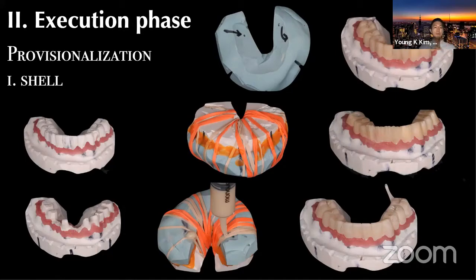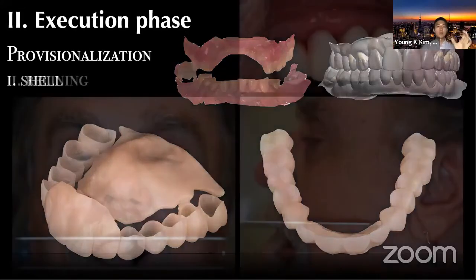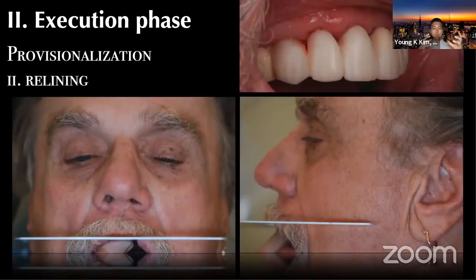It's also very important. It's a great way of learning how to handle those with the basic principles behind the shell fabrication. And we have scannings, and we can mill the PMMA, and these are types of treatment routes in a normal private practice, and we can reline with the palatal references, and we can reline predictably. And you have a temp shell, and you have prepped teeth, and you're about to reline. What are the things that you should consider?